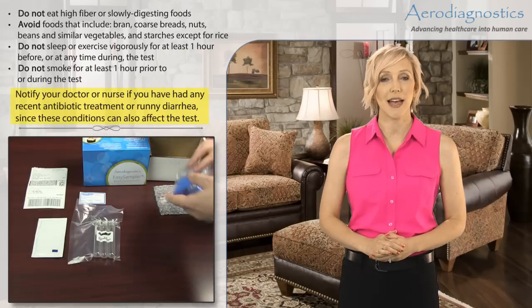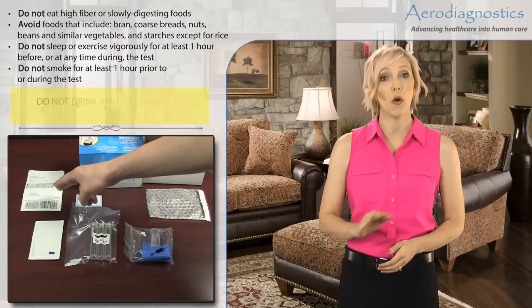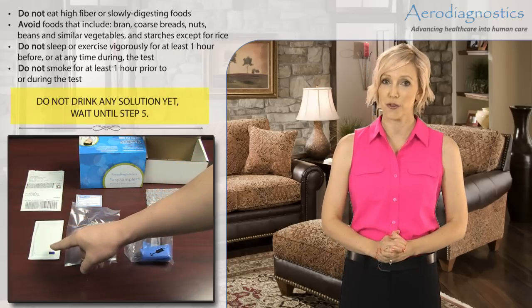What you eat may interfere with the test, so it is important that for at least 12 hours before the test you eat no food and have only water to drink.